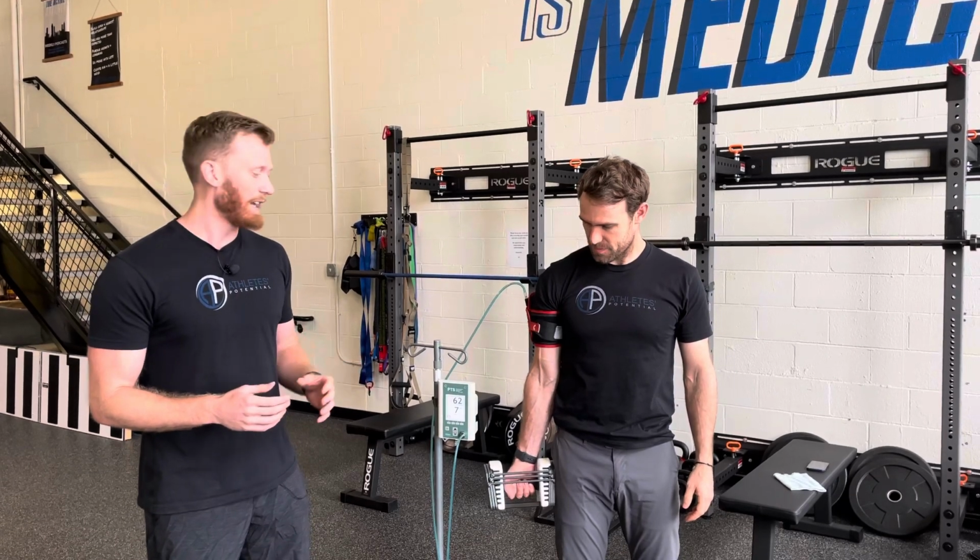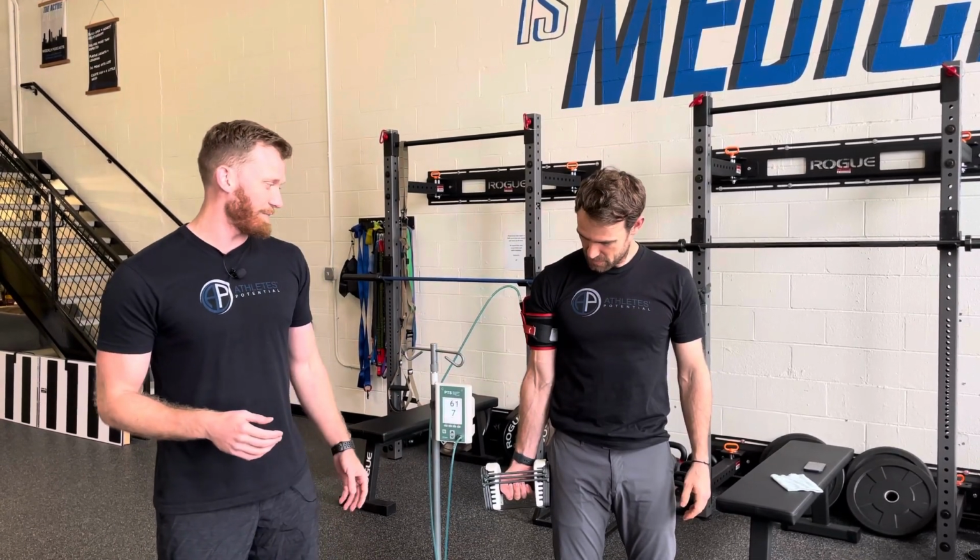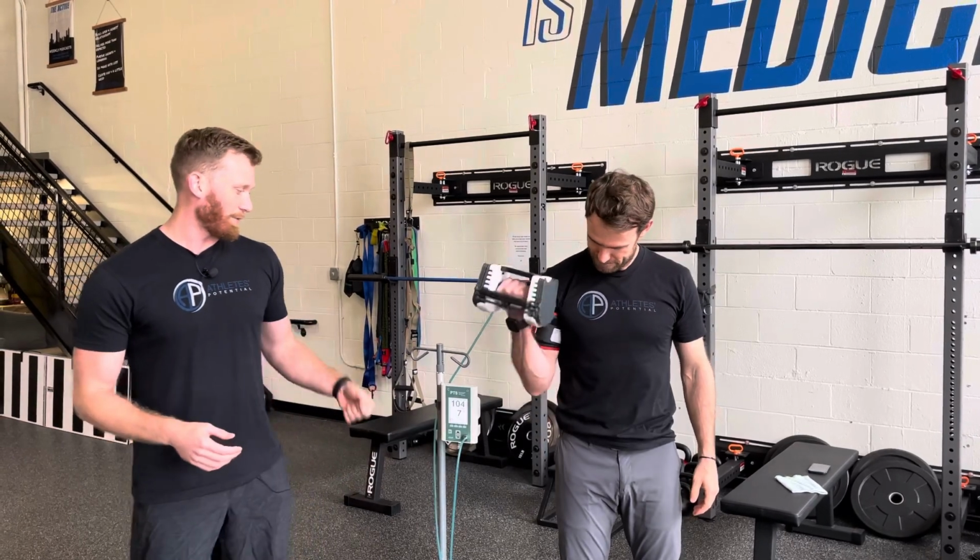One of our all-time favorite treatment styles here at Athletes Potential is called blood flow restriction training, particularly personalized blood flow restriction training. Now, Sam, you can see he's pretty blown up with his veins right here. He's been doing a few reps, so go ahead and hit some reps for us here, Sam.